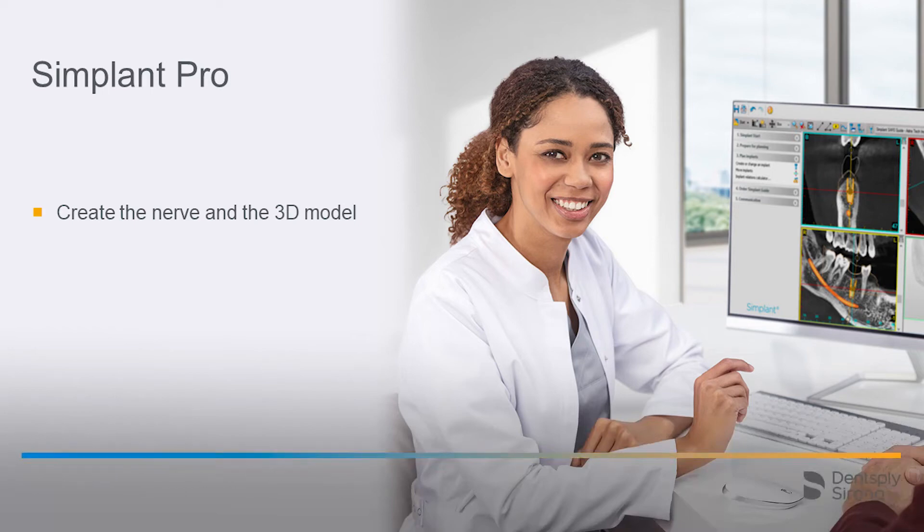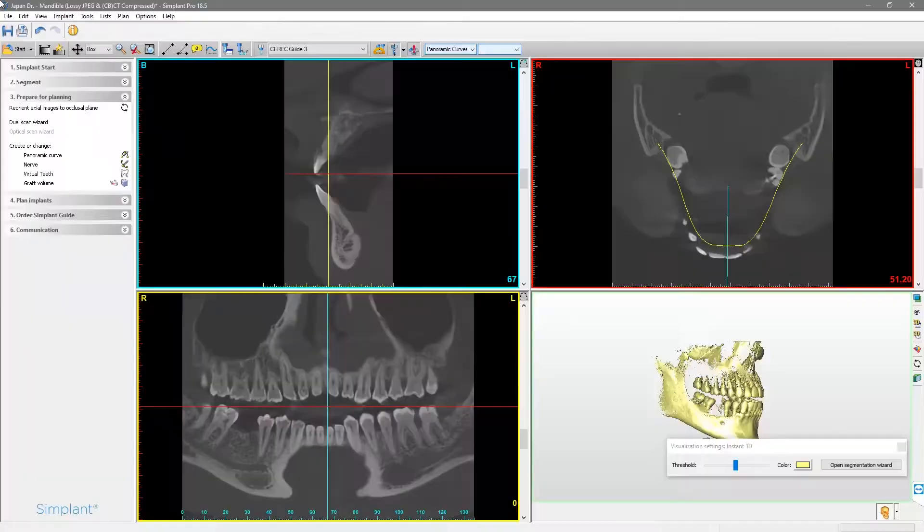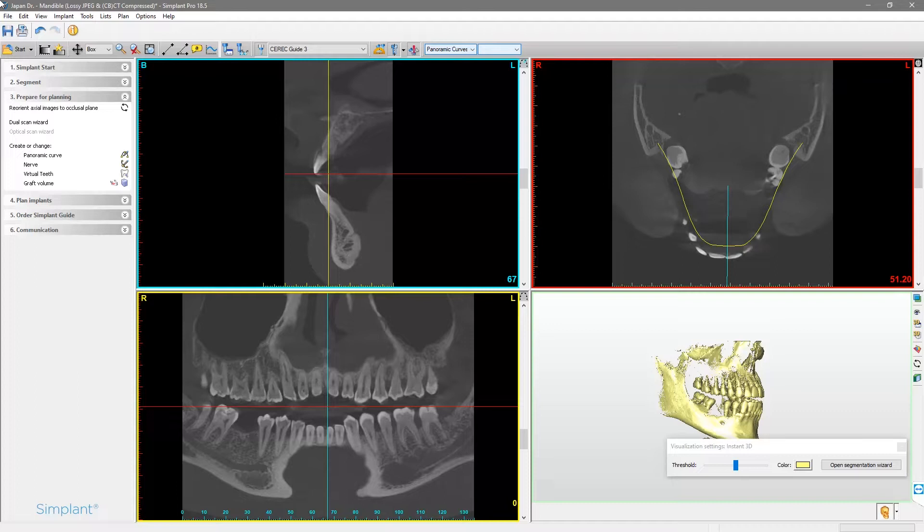Welcome to this video tutorial on the topic of Simplant Pro. If you are planning a case in the mandibular, you will need to trace the nerve on the treatment side. The software will automatically warn you when you plan an implant too close to the nerve.